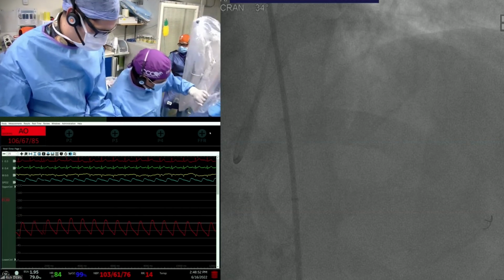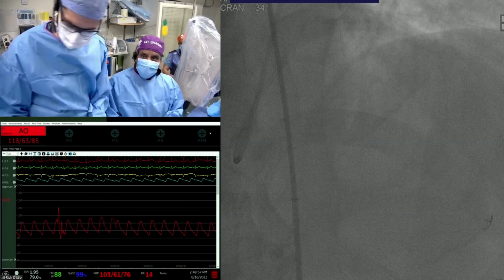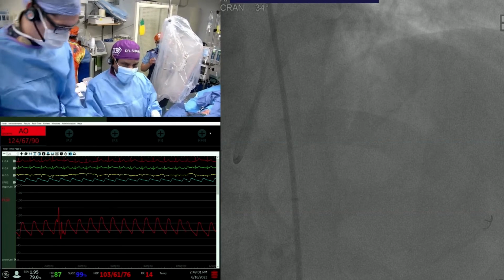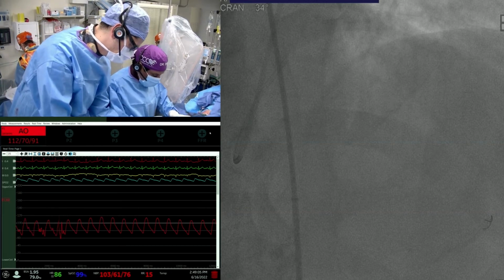This aneurysm. I mean, without the trial, I would have just done the ROTA and then maybe in the end, if needed, imaging. But this we wanted to show. But as you said, I'm sure you probably have a connection with the FDA.